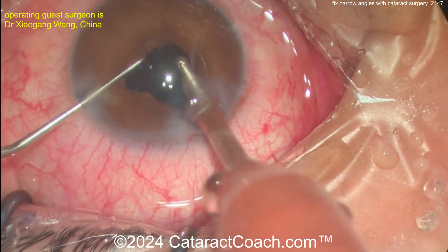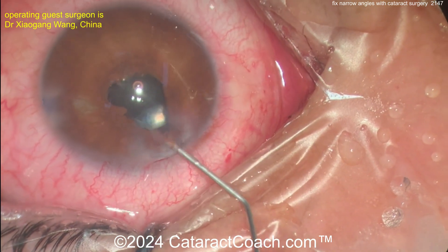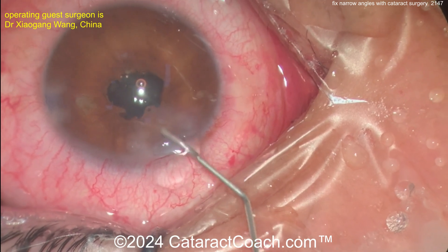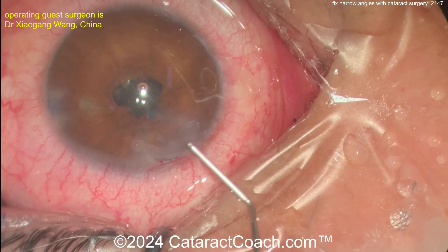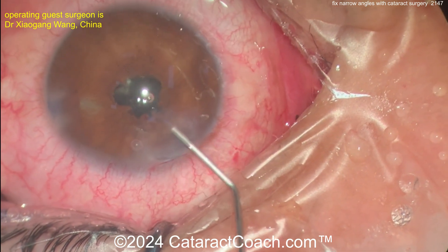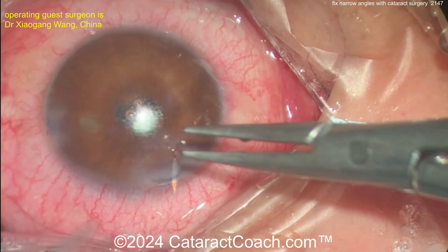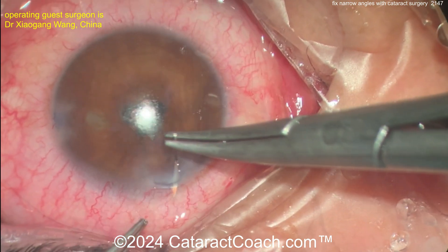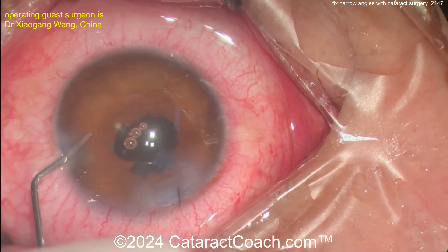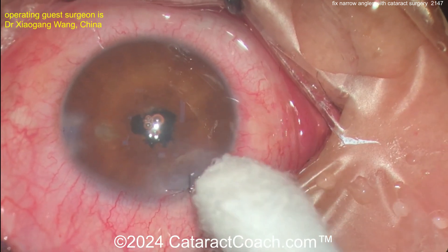Cleaning up here, removing that viscoelastic — beautiful case. There's a little iris prolapse; make sure you solve that. A bit more viscoelastic can be okay, but you don't want to leave it in the eye due to the pressure spike. Better to just throw in a 10-0 nylon suture — and there it is! Great minds think alike; beautifully done.